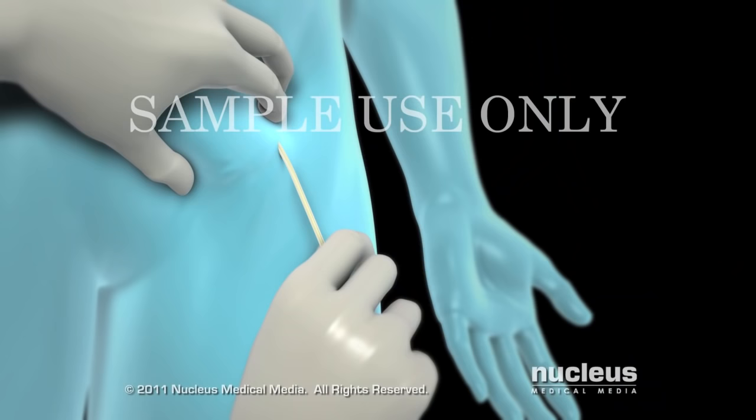Finally, your surgeon will remove the catheters and close the incisions in your groin. The procedure will generally take two to three hours.